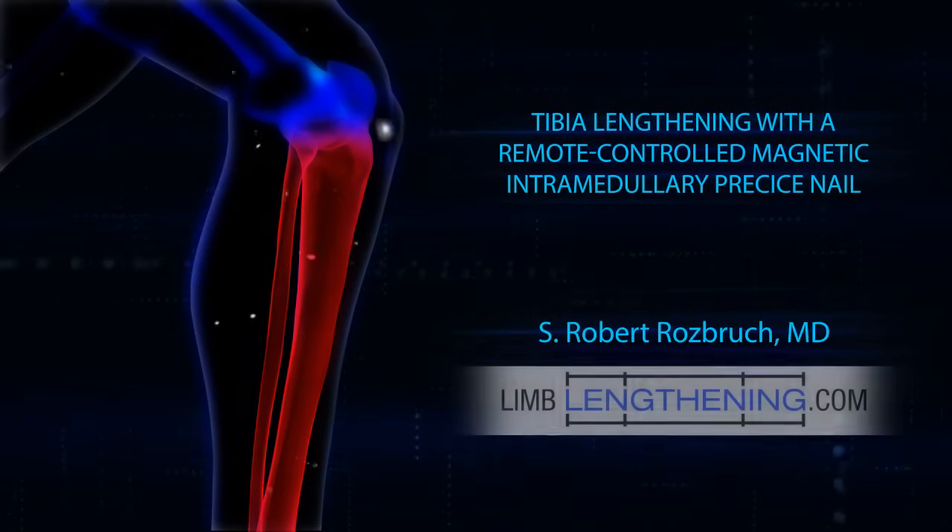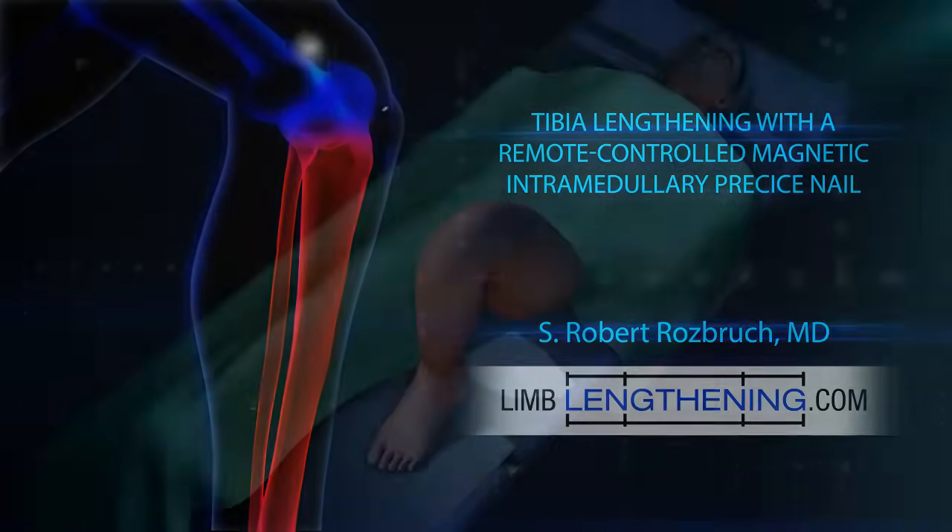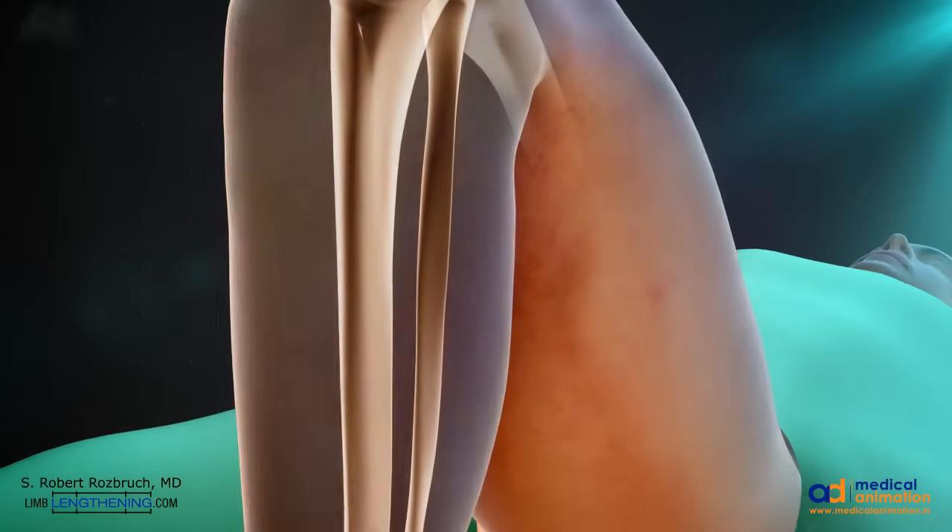Hi, this is Dr. Rob Rosberg from Hospital for Special Surgery. We're going to talk about tibial lengthening using the magnetic motorized intramedullary nail.